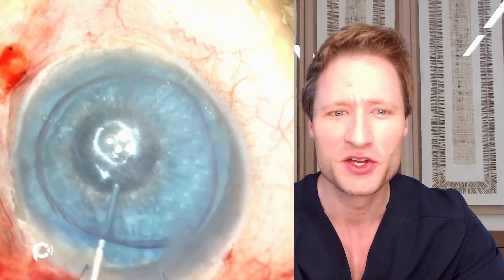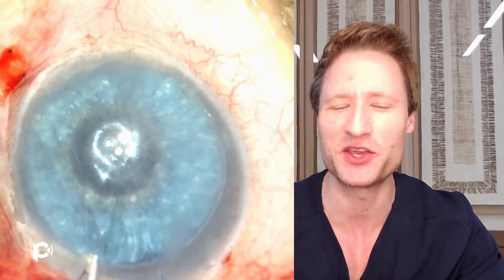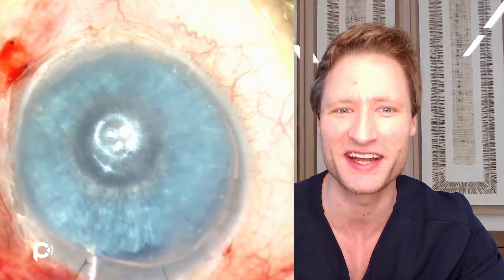The first learning point is that a background of complexity does not mean you have to switch to DSAEK instead of DMEK. Just because the eye has a complicated history does not mean you need to reflexively fall back to a more antiquated version of the operation.